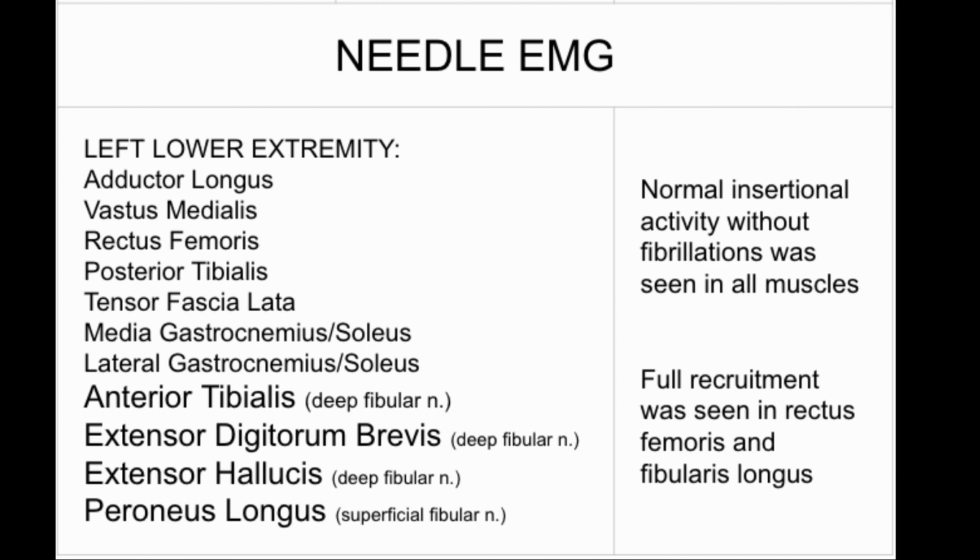Following the nerve conduction study tests, we moved on to needle EMG. A comprehensive needle EMG evaluation was completed of the left lower extremity, which included needle sticks of 4 fibular nerve muscles. No abnormalities were seen on needle EMG. So if you're still with me here, you're probably saying, well, what the heck, Hake? You said this is going to be an interesting case, and all you've shown us is some important technical details in a normal study. But this is where the case starts to get interesting.